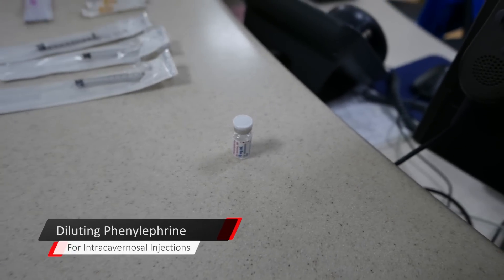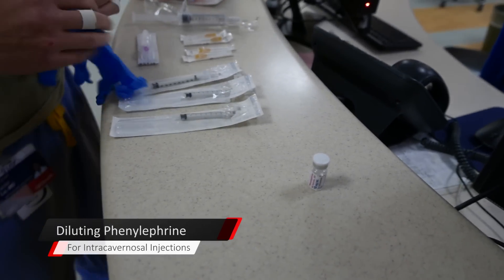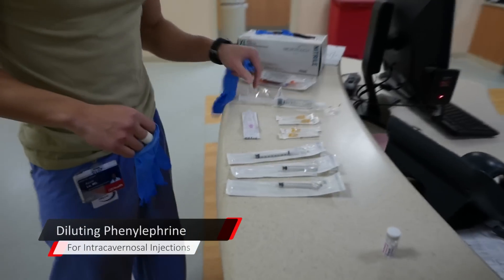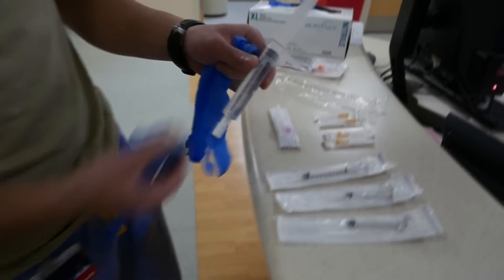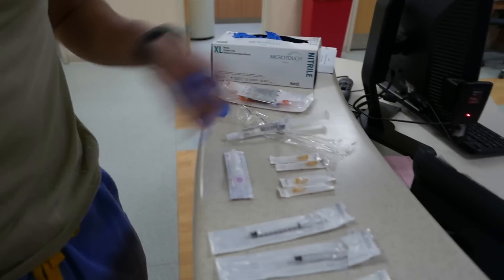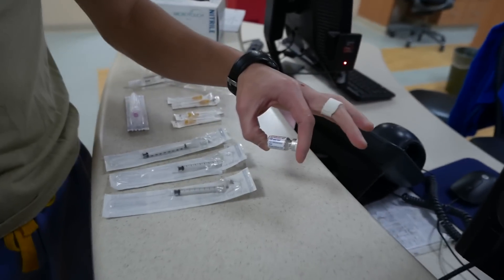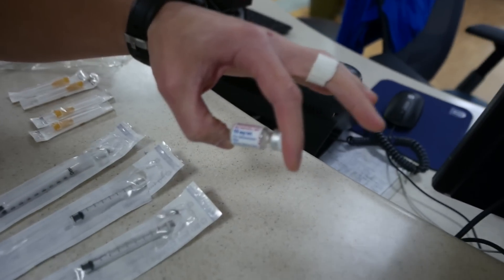Okay, so Kevin, we're going to mix up some phenylephrine. Tell me how we're going to do it. All right, so I've already pre-labeled my syringes here — 500 mics per mil. We have a 10 mg per mil phenylephrine solution here.